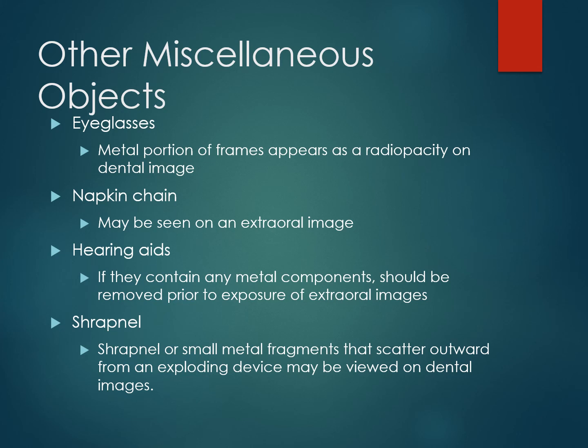It's up to the patient and their doctor to determine whether or not that shrapnel was worth removing at the time, or maybe it's not harming them, so maybe they just leave it in there, and that's okay. And so if you see something like that, it's a great time to ask your patient, like, hey, what's going on with this? What happened here? It is okay to ask your patient, what happened here?